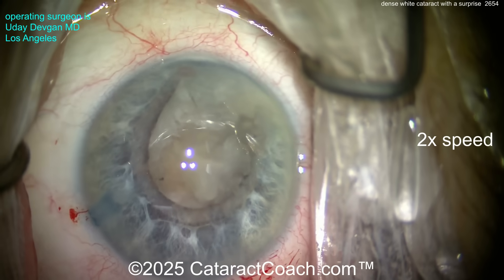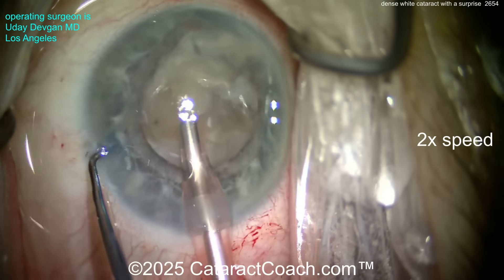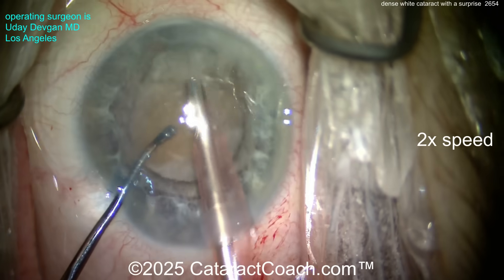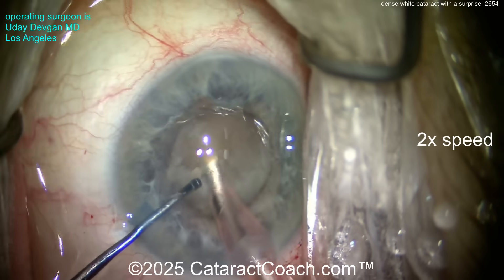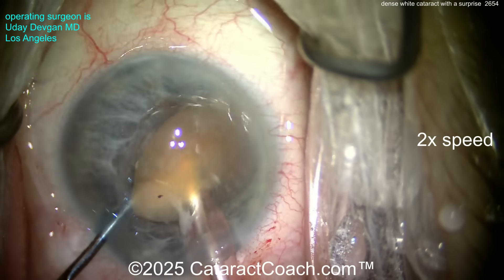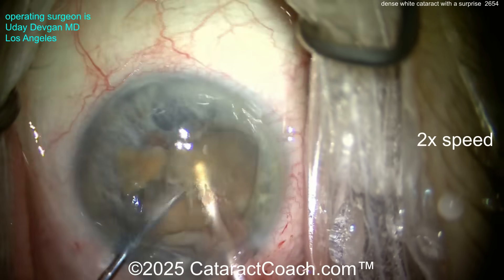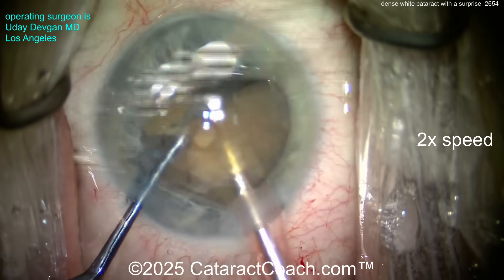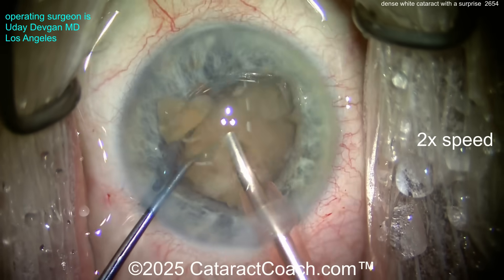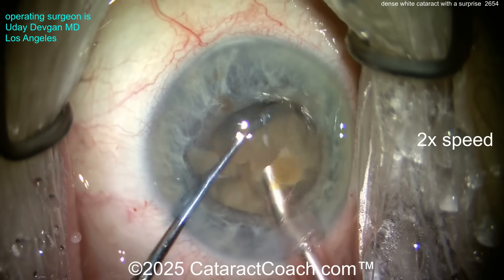I don't want to deal with a small pupil — patient is on Flomax, small pupil, and there's maybe some iris prolapse coming up. It's going to be tough. Plus the patient has a very deep orbit — very thin with very little orbital fat, so these eyes are really sunken in. We're operating super deep here. Now we're going to buzz into this cataract and break it up into smaller pieces.